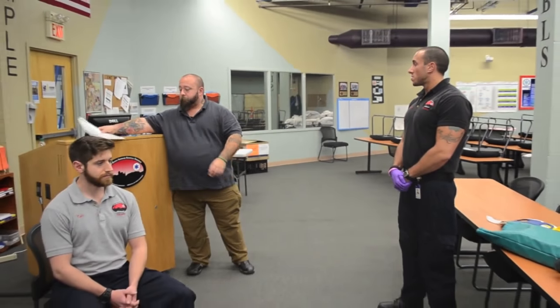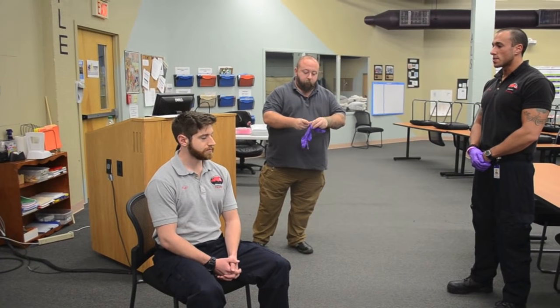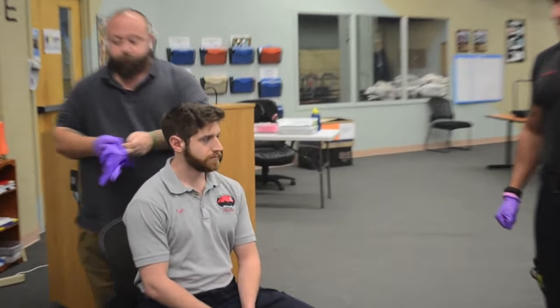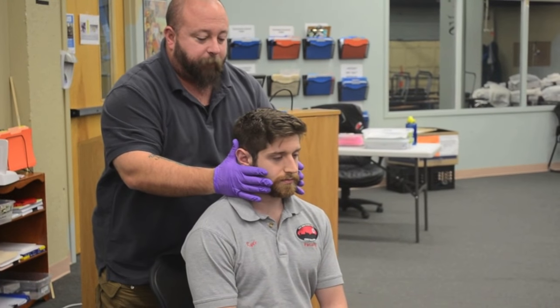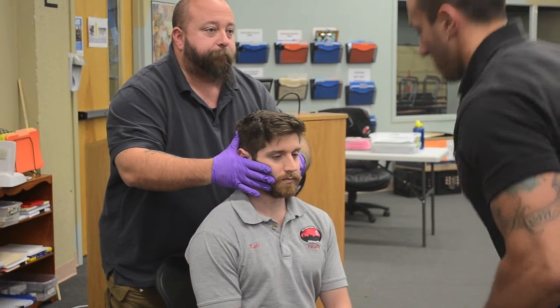The scene is safe. I have my proper BSI on. At this time I am going to ask my partner to hold the C-spine in in-line neutral stabilization and not let go until I tell them to. Sir, I am just going to hold your head still in an in-line position. Please don't move your neck.